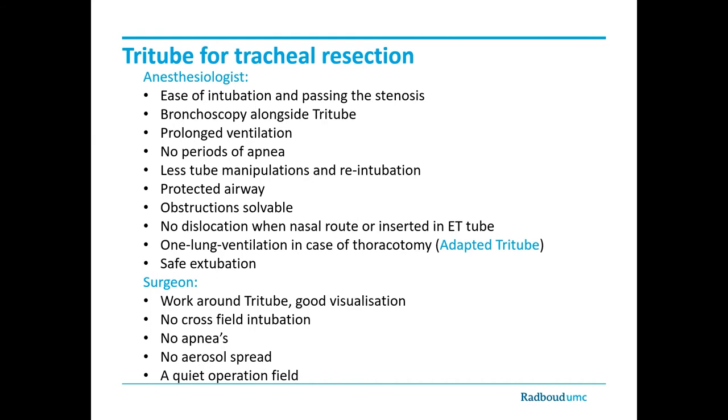In this last slide, you can see our conclusions regarding the use of Tritube for tracheal resections. One of the advantages is that it's much easier to pass the stenosis during intubation, and bronchoscopy has much more possibilities with Tritube. Of course, there's a reduced need for periods of apnea, and there are fewer tube manipulations and re-intubations during surgery. The airway is protected for a longer period. Of course, we saw some obstructions, but in all cases they were solvable. And we think the nasal route results in a more stable position of the Tritube.